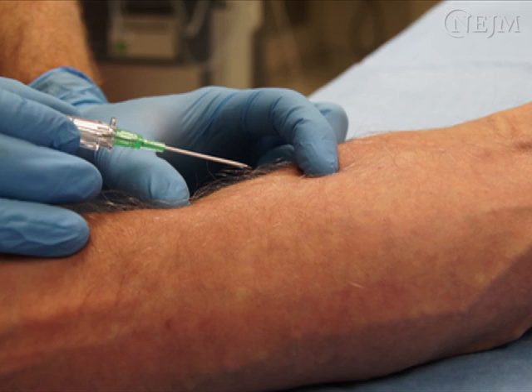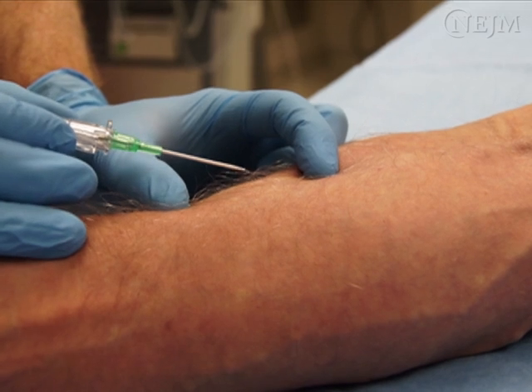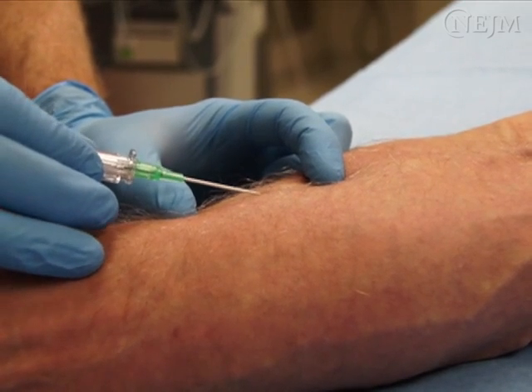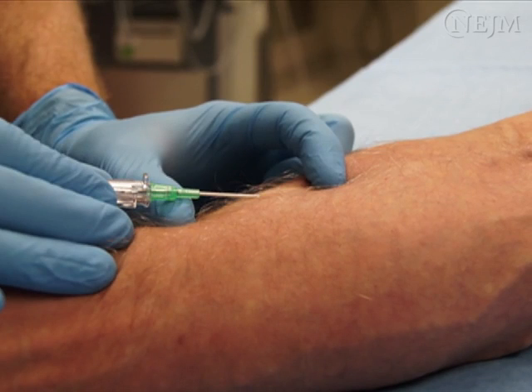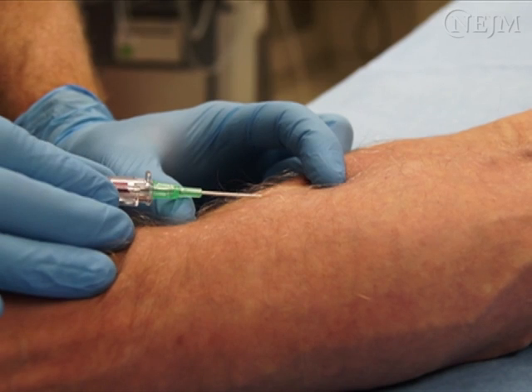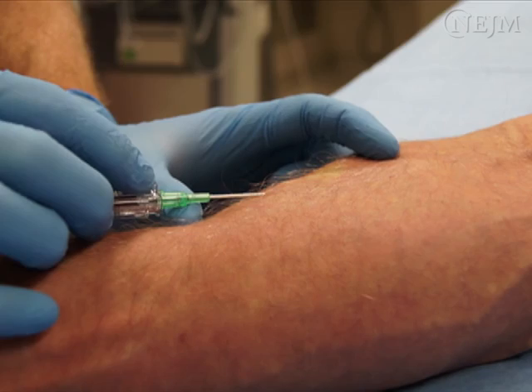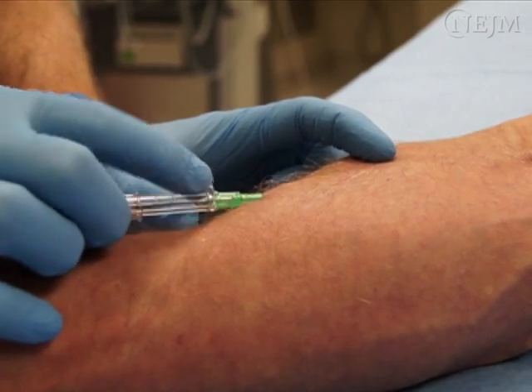The needle approach should be along the course of the vein at an angle of 10 to 30 degrees to the patient's skin. Puncture the skin and then the vein with a quick forward motion so the needle tip penetrates the wall of the vein instead of just pushing it aside. When the needle tip enters the vein, there will be a flash of blood into the catheter. Decrease the angle of the needle and advance 1 to 2 millimeters further to ensure that the entire needle tip and the tip of the catheter are fully within the vessel. While holding the needle still, slide the catheter into the vein.